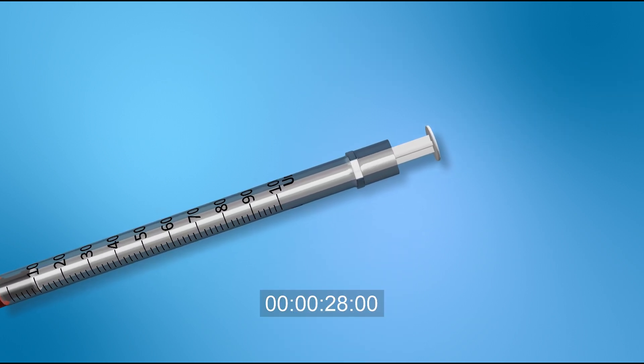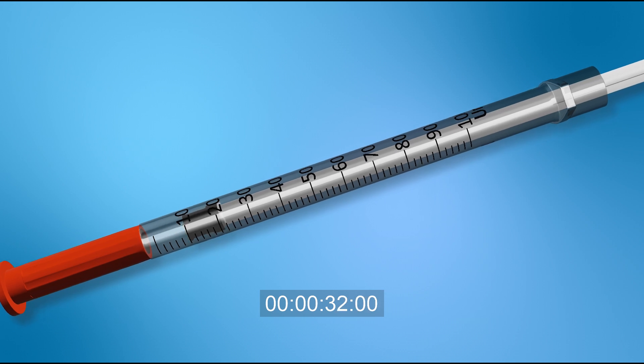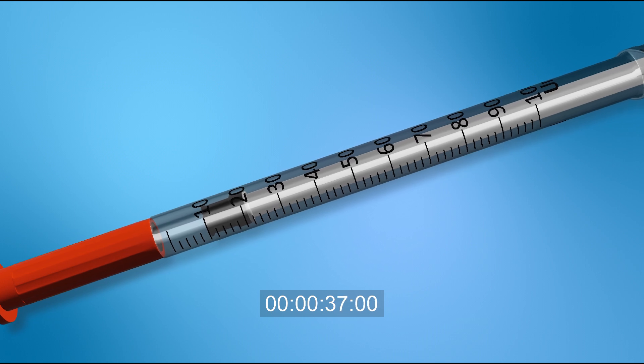Take the white cap off from the syringe. Draw the plunger of the syringe to the number of units you will be injecting. For example, we are using 10 units.